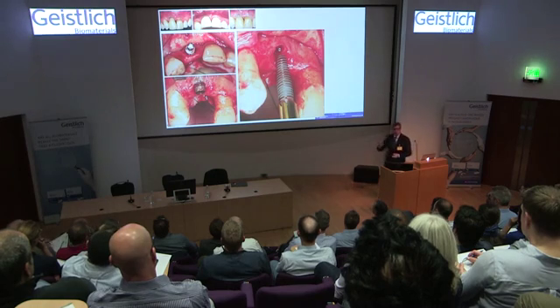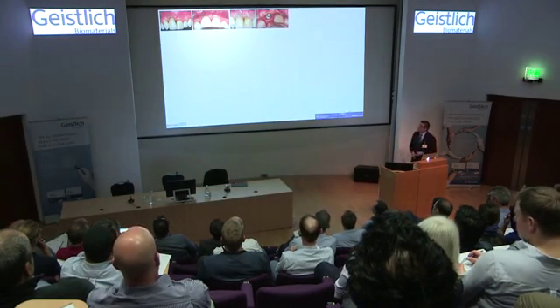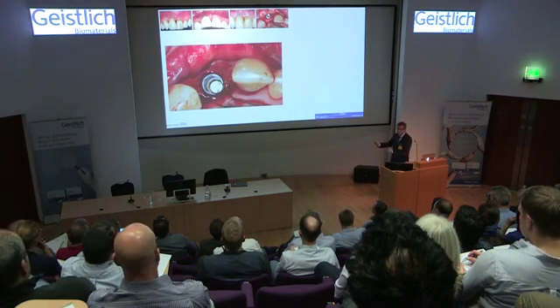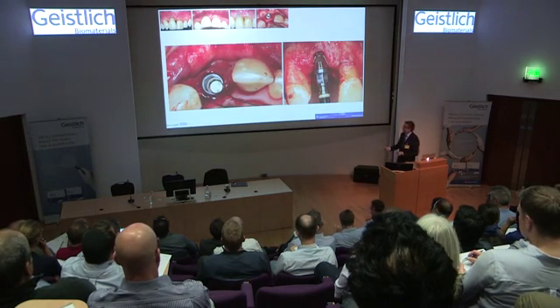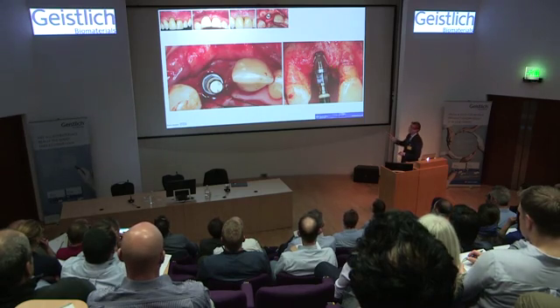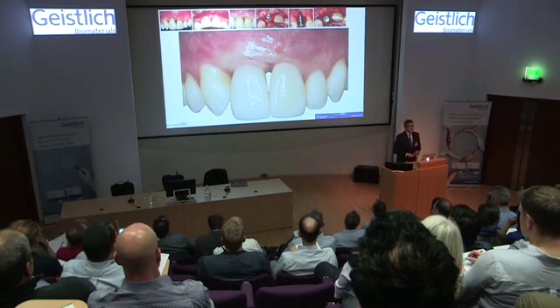These days we have techniques where we can literally unwind implants very minimally in terms of invasiveness without damaging what is left there. And then we go in to replace that implant in the correct three-dimensional position, getting the implant back into where it needs to belong, a screw-retained type of restoration. And I am not compromising the position of the implant. I am looking at this tooth here. I'm looking at the interdental bone, because that is what is going to guide our outcome. And then we go in with the technique using the regular GBR, and that is the outcome for the patient.